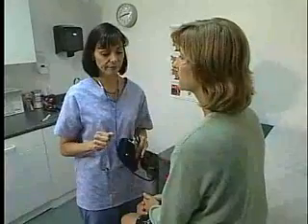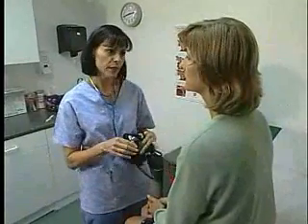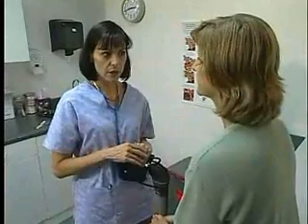What if you don't get a good reading? Well, I'll check it again in a minute or two, which probably is what the doctor's going to tell me to do with you. Your blood pressure has never been high like that. Yeah, I've been under a lot of pressure lately, both at home and work.